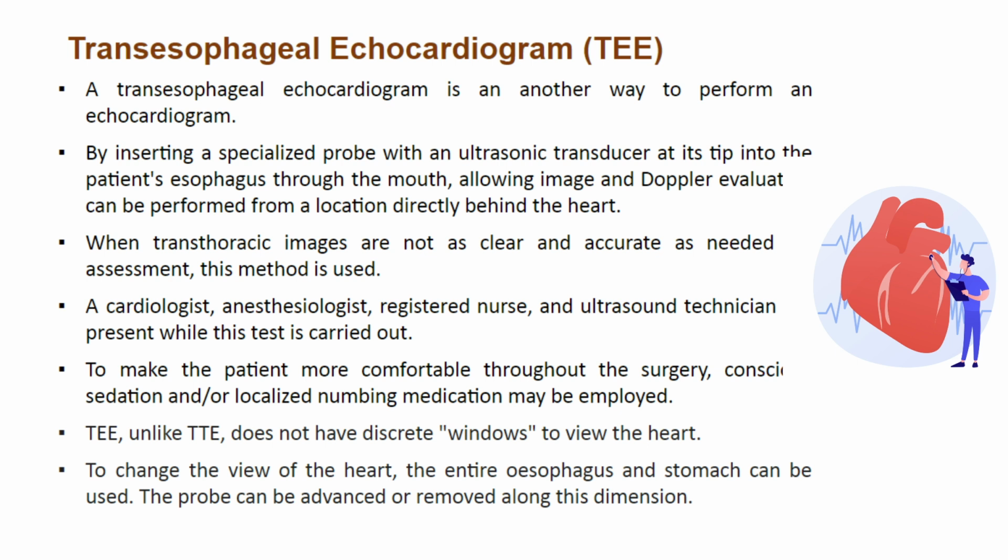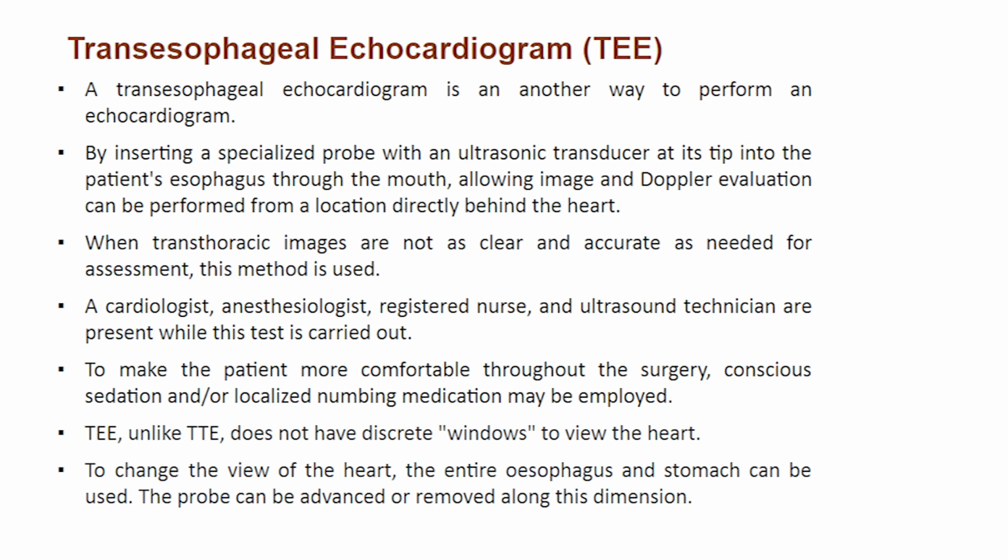A cardiologist, anesthesiologist, registered nurse and ultrasound technician are present while this test is carried out. To make the patient more comfortable throughout the procedure, conscious sedation and/or localized numbing medication may be employed. TEE, unlike TTE, does not have discrete windows to view the heart. To change the view of the heart, the entire esophagus and stomach can be used.